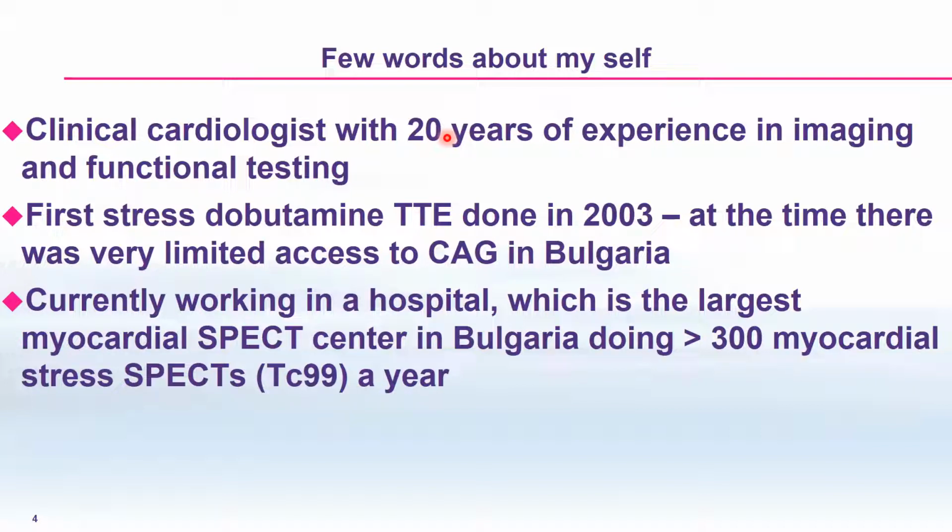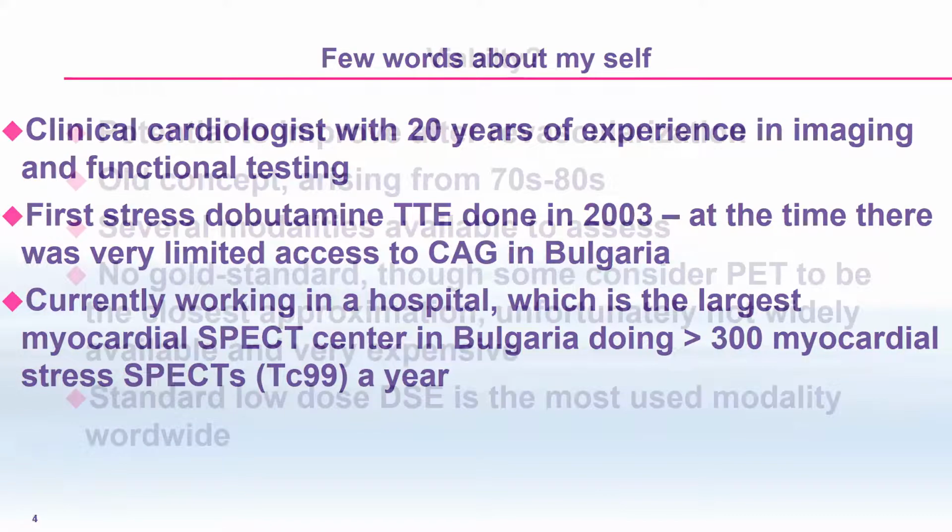I'm currently working in a hospital, which is a SPECT center. So every Tuesday, we call 6 patients and we do them on a bicycle. We use technetium 99, we use MyoView, and we are, I believe, probably the largest cardiac nuclear center in Bulgaria. We do it consistently every single week. Sometimes we have slots on Wednesday.